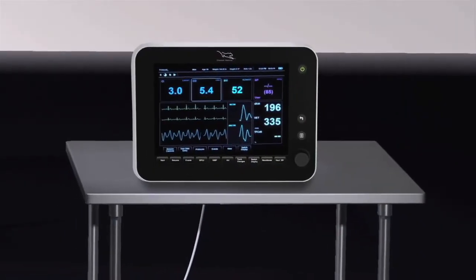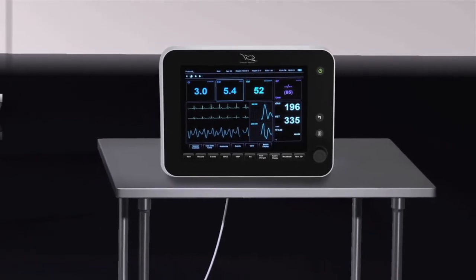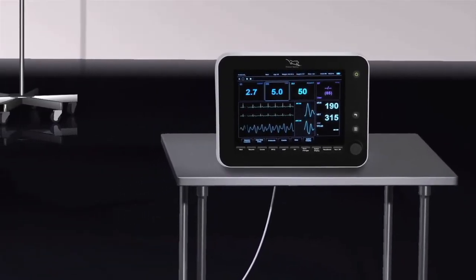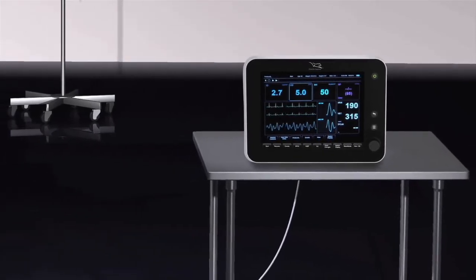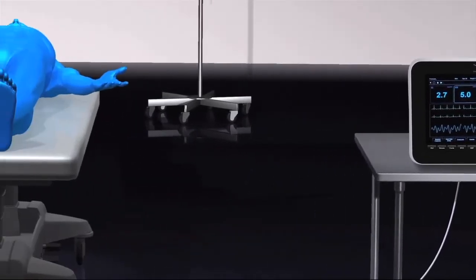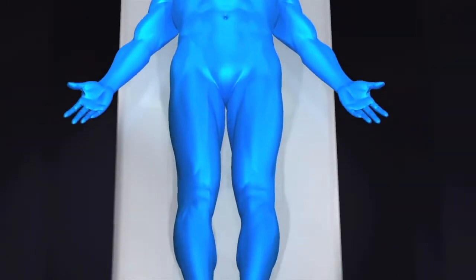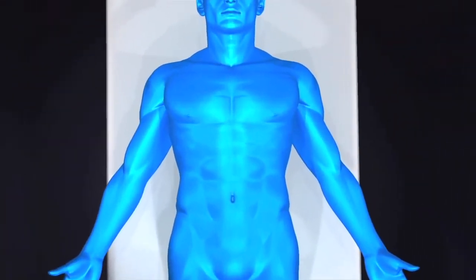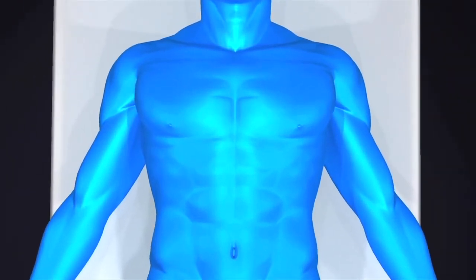The Starling SV provides continuous, accurate, non-invasive hemodynamic monitoring and empowers fluid management in virtually any clinical setting. It utilizes bioreactance, a technology that was developed by Cheetah Medical scientists over years of research and development, followed by extensive testing and validation.